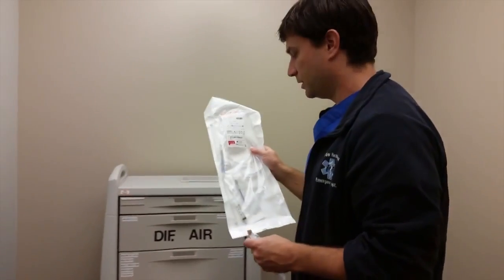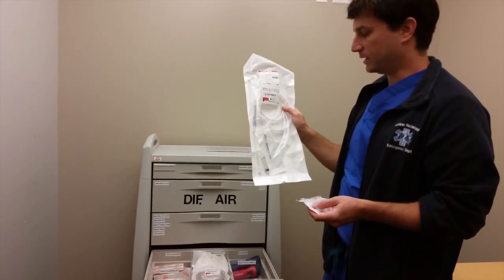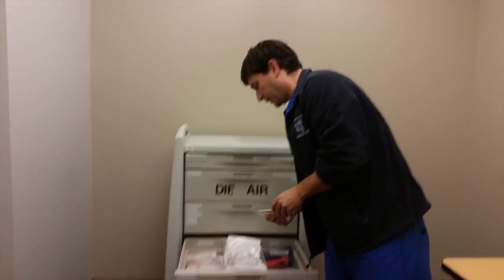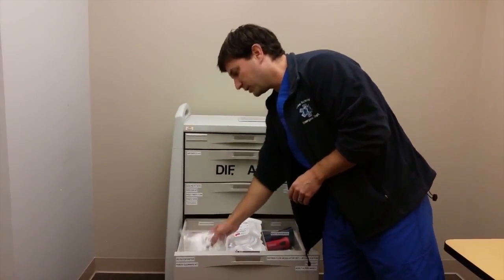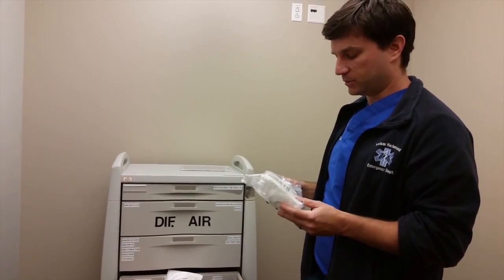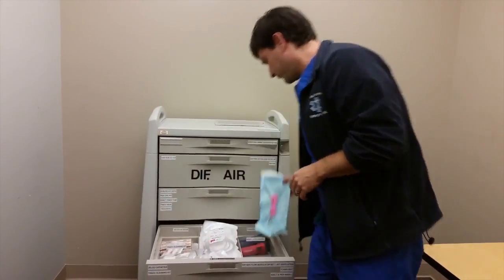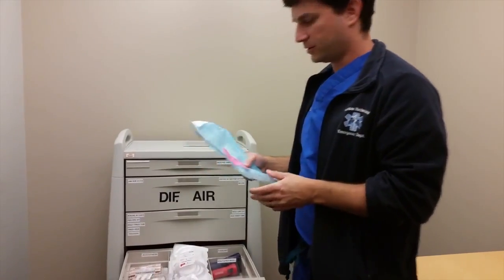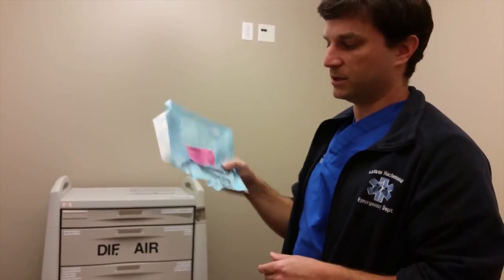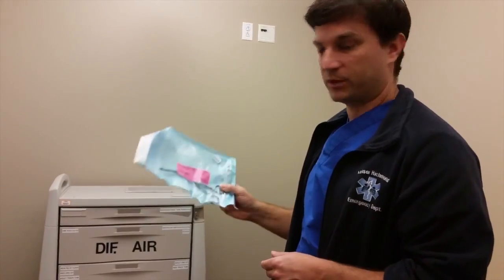I will say though, sometimes they will do an entire OR case, like an ENT type case, with this type of setup, and you can successfully ventilate people. It's just challenging. Not ideal, and I will admit that I've never actually done that. It's all theoretical, but the theory is just get the oxygen in and keep them oxygenated that way. This is just a tracheostomy kit in here, and some other implements, as well as the McGill forceps, which used to live up here and now came down here. These would be used to help you with your awake airway, passing the tube in, removing foreign bodies, etc. They happen to be down here just because they're currently placed on the side.